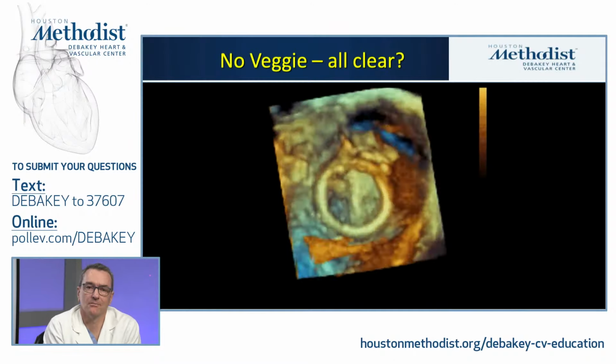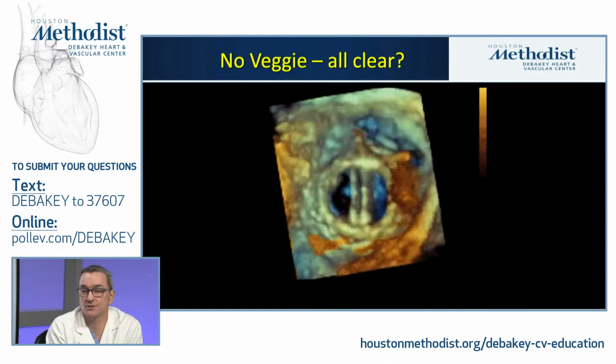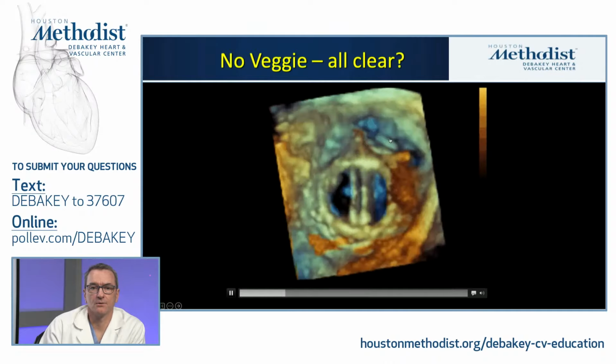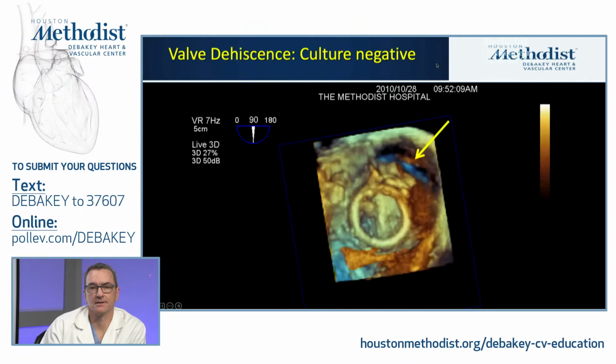This is another case of a mitral valve with a mechanical prosthesis. No paravalvular defect noted, no vegetation noted, very, very high flow. And this looks initially like things are okay. However, all of this space here, sort of between 12 and 2 o'clock, is not echo dropout. This is actually an enormous dehiscence because of recurrent culture-negative endocarditis. In this case, culture-negative because of the long history of parenteral antibiotic use after having a prior episode of endocarditis.